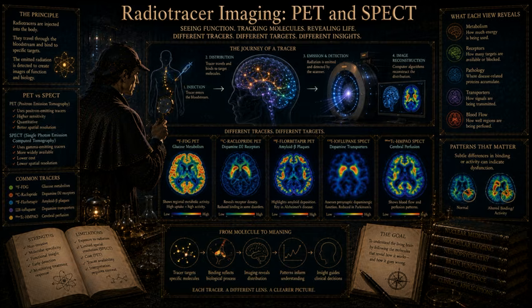Initially, people assumed the problem was clinical. They argued the patient populations were too heterogeneous, or that the duration of untreated psychosis was skewing the data. But eventually, a brilliant group of investigators decided to run the ultimate test. They scanned the exact same individual patients with both tracers, and the discrepancy persisted within the very same brains. So it wasn't the patients. The patients were consistent, the tracers were lying.